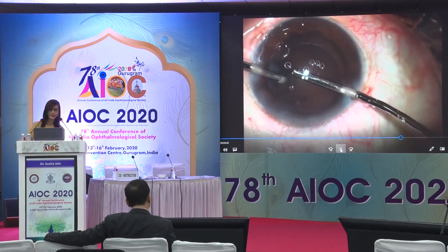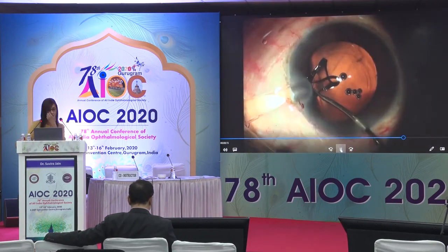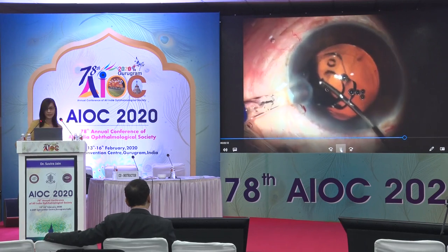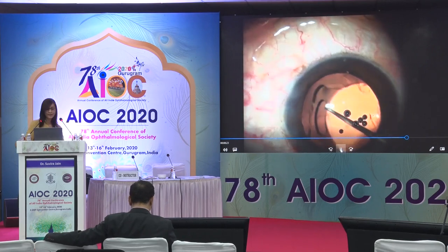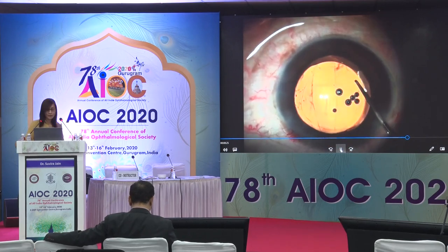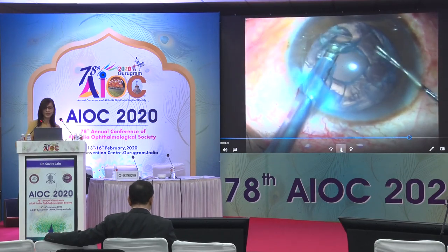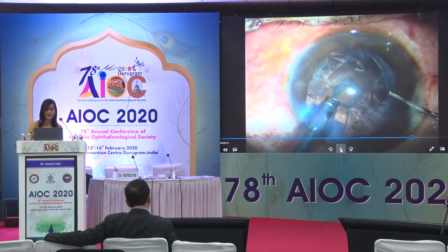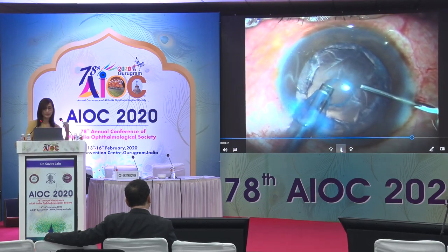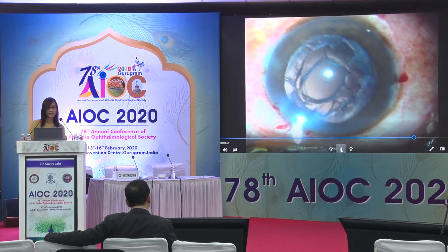Towards the second half of IA, the surgeon notices the typical elliptical equator-to-equator opening in the posterior capsule. Since there is no vitreous disturbance, the surgeon is able to place a one-piece Zeiss lens carefully in the confines of the bag after using a dispersive viscoelastic before injection. In another case, everything is going well but the surgeon notices typical fish-mouthing towards the end of nuclear removal, signifying an opening.